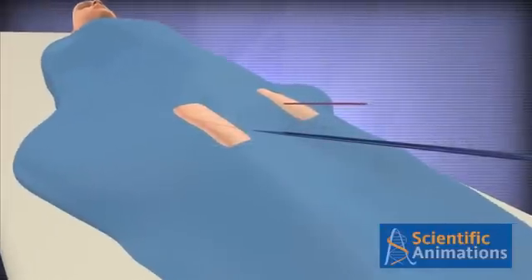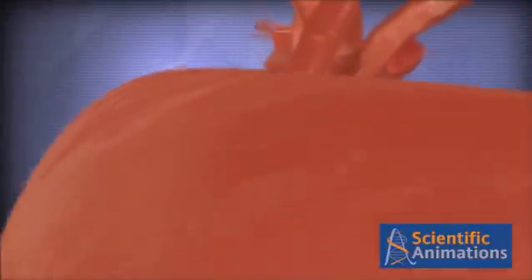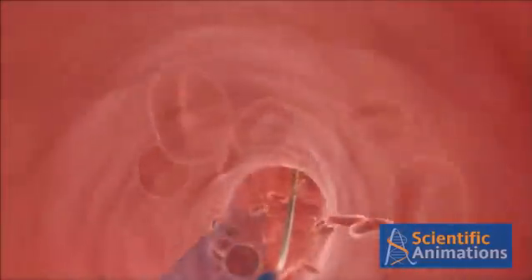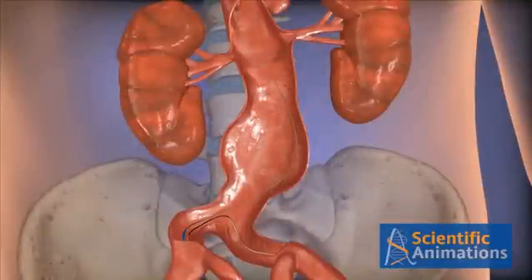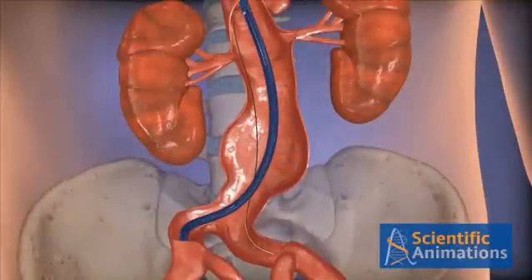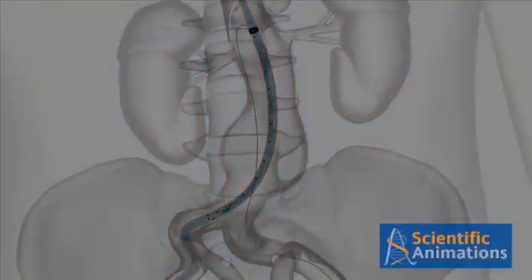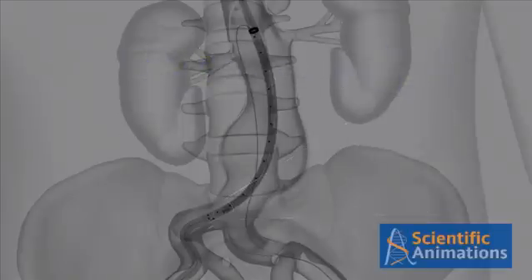To start the deployment, load the delivery system onto the stiff wire and advance into the aorta. When the device limbs are above the aortic bifurcation, verify the contralateral limb orientation indicated by the RO marker.